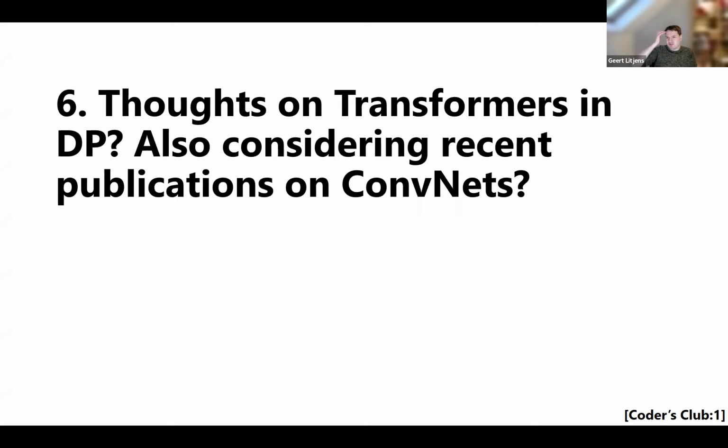Which does weakly supervised learning with attention based mechanisms integrated with multiple instance learning. I think you could make a similar model with transformers where you can maintain spatial awareness of where the different areas originate from, which CLAM does not. I think there might be some use case there, but it's not something we have really explored.